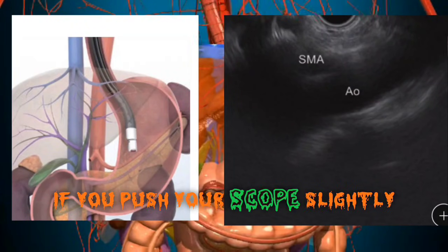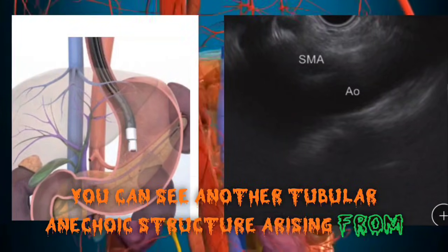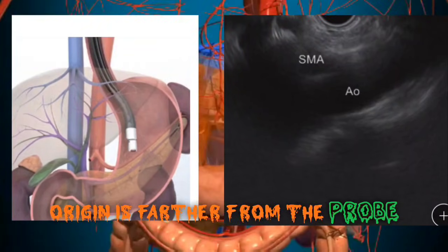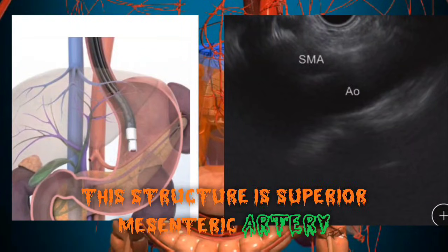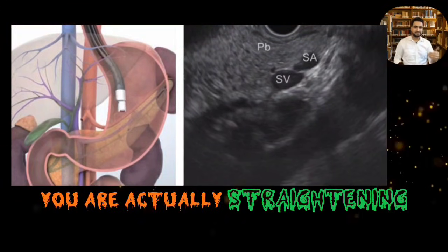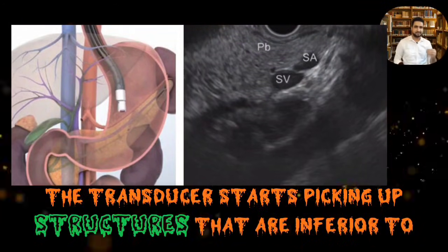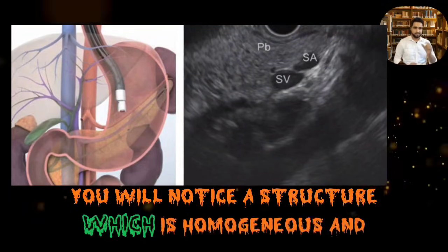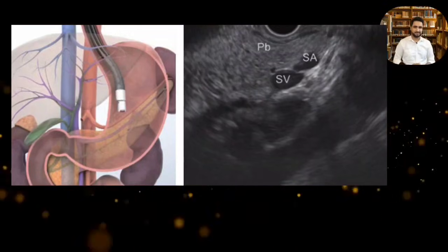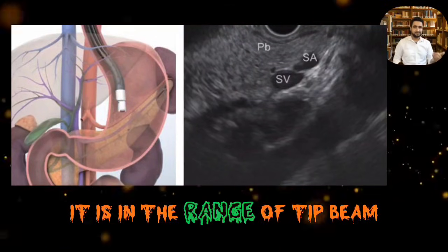If you push your scope slightly downward you can see another tubular anechoic structure arising from the aorta — again posterior to anterior in direction. This structure is the superior mesenteric artery. If you then slightly move your big knob away from you, you are straightening the transducer and the tip starts picking up structures inferior to it. You will notice a homogeneous, slightly hyperechoic structure compared to liver — this is the pancreas, appearing on the left side of your screen because it is in the range of the tip beam.